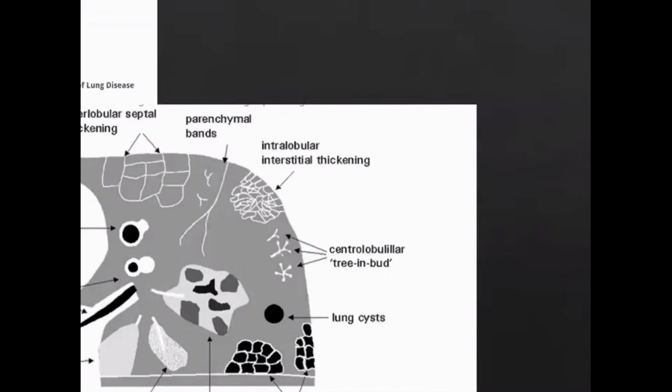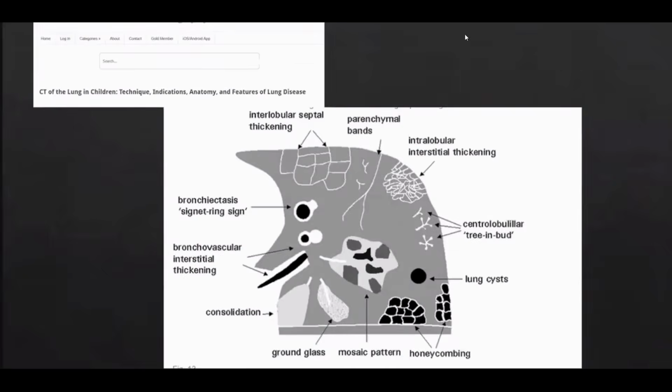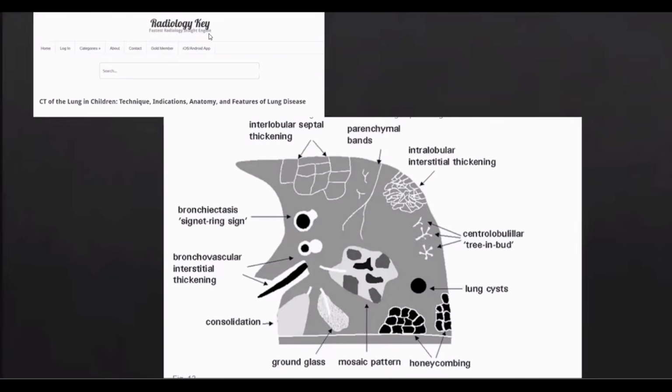Let's review our discussion for today. Okay, this is from the Radiology Key website. We have different parenchymal patterns.